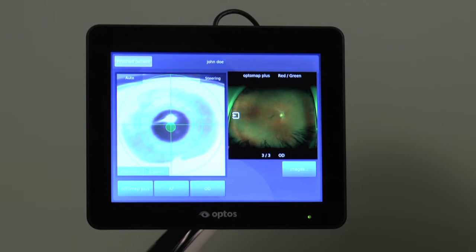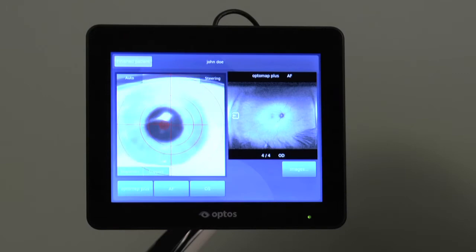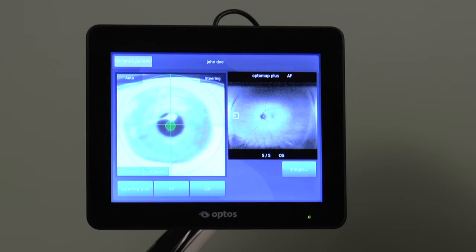Then change laterality from OD to OS and instruct the patient to pull back slightly, turning their head and aligning their left eye with the target. Press the capture button when the crosshairs are centered on the pupil and the target is green.